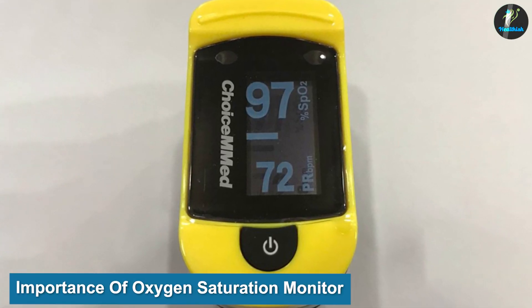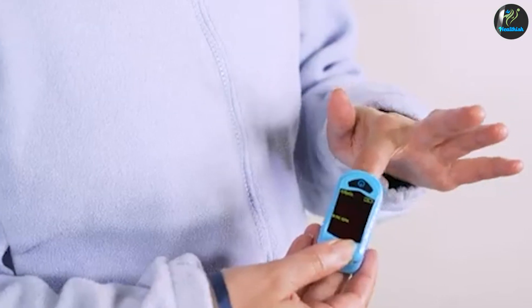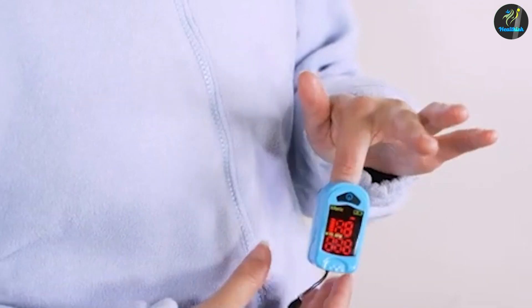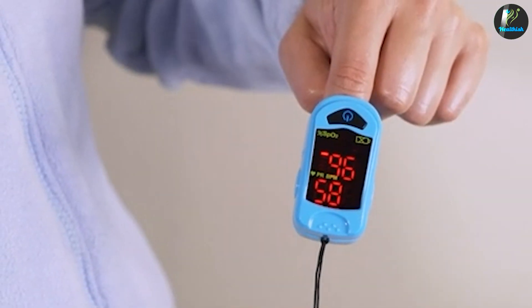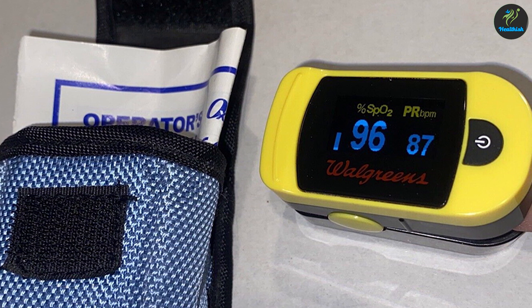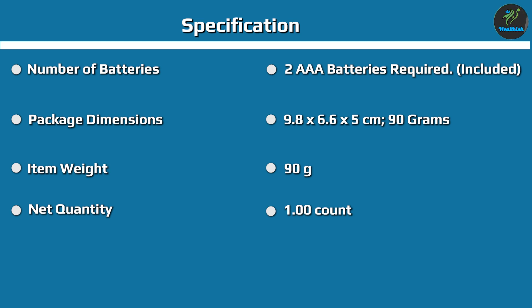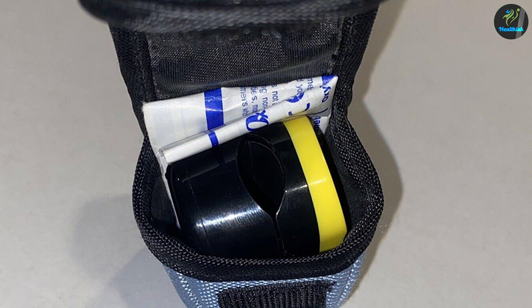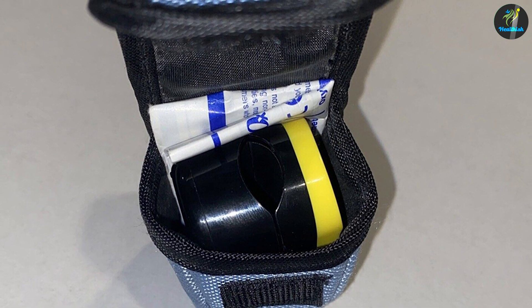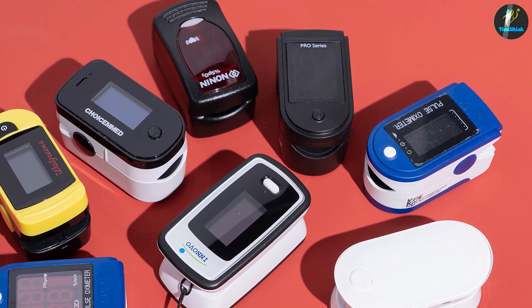It is important to understand that oxygen is a necessity for every organ in the body. In its absence, cells malfunction and wither away, and cell death eventually leads to organ failure. The body uses the lungs to get oxygen to the organs, which is then distributed into the blood through hemoglobin proteins found in the red blood cells. The job of a pulse oximeter is to measure the amount of oxygen, also called oxygen saturation. Oxygen saturation levels should normally be between 90 and 100%; if they fall below 90%, you should go to the hospital.